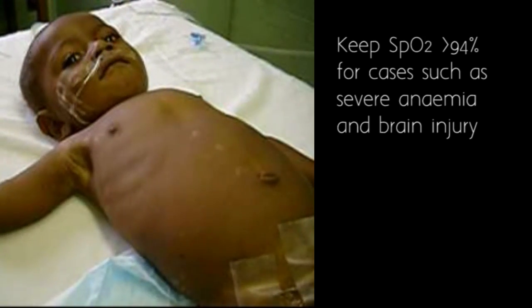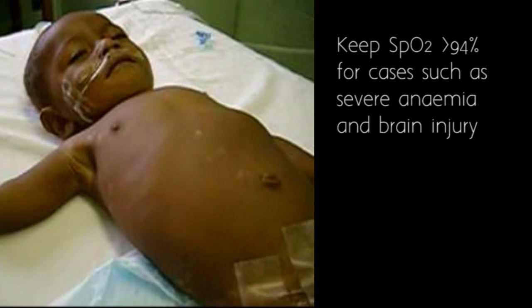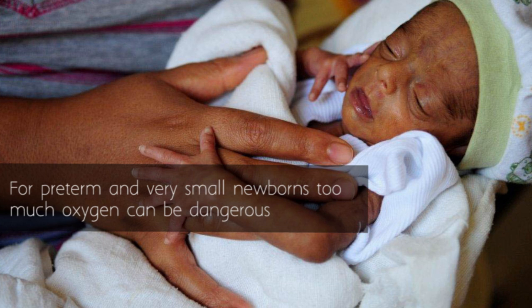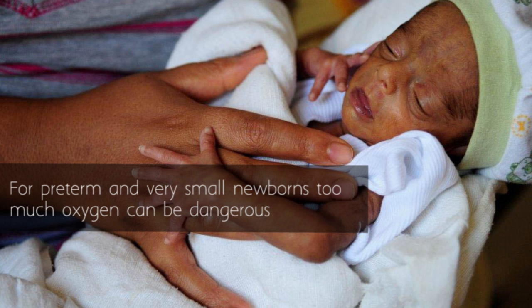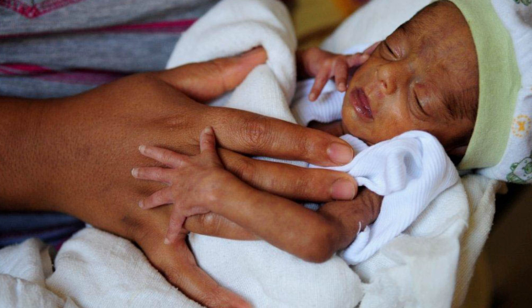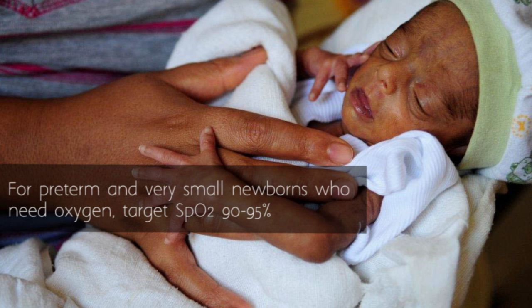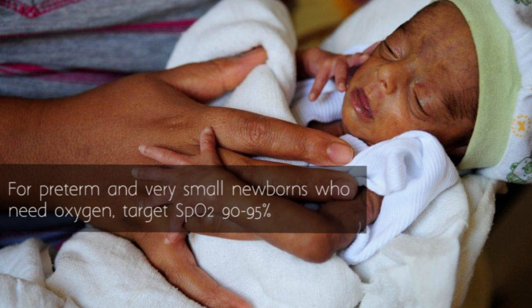In some situations, such as severe anaemia and brain injury, oxygen may be started when saturations are less than 94%. In preterm and very small newborns, it can also be dangerous to give too much oxygen, causing damage to the eyes and lungs. Pulse oximetry is useful to prevent the administration of too much oxygen. We recommend aiming to keep oxygen saturations between 90% and 95% for preterm and very small newborns who need oxygen.